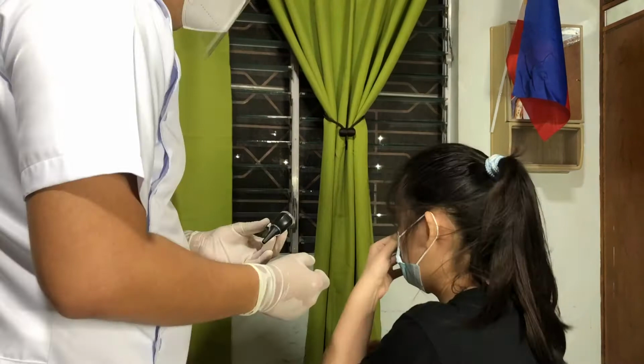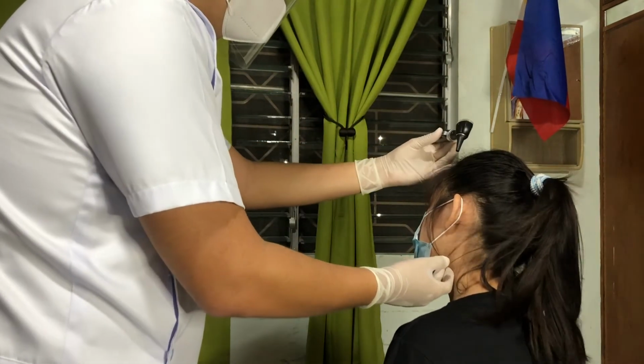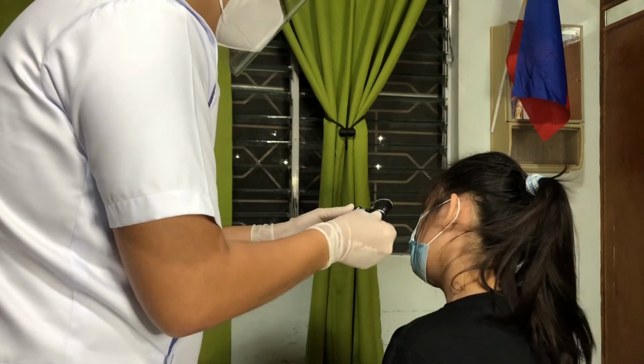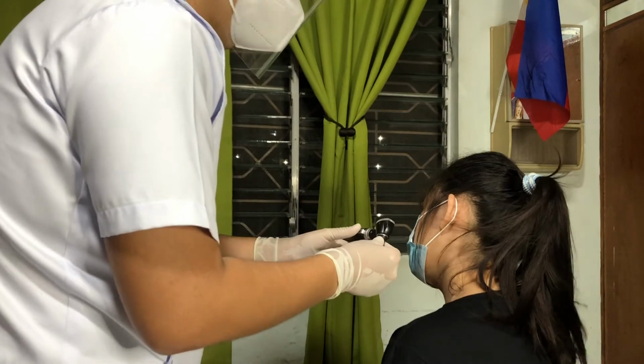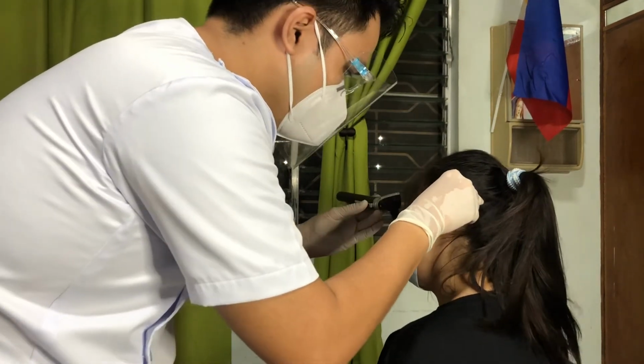Inspection of the external auditory canal. Inspect the unaffected ear first. Explain the procedure to the patient. Ask the patient to tip the head slightly toward the opposite shoulder, away from the side being examined. Use the largest speculum the patient's ear can accommodate. With the other hand, straighten the ear canal by pulling the auricle gently upward and backward.